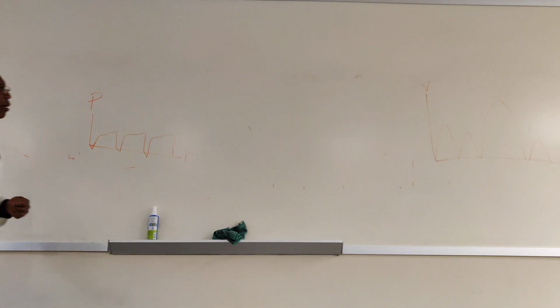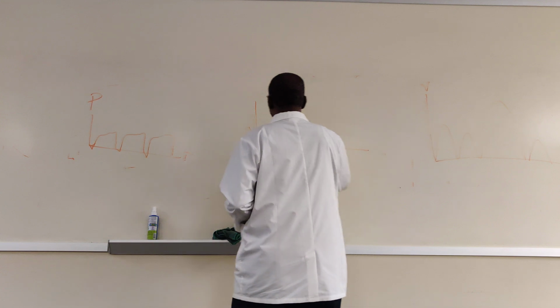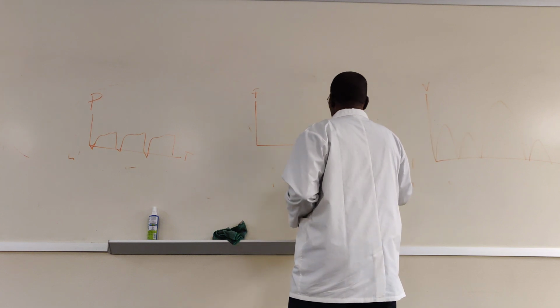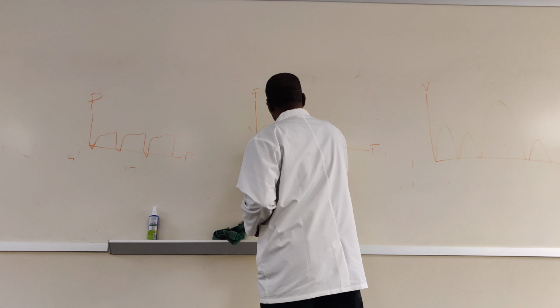And then for the flow time curve, what we call that is the sine flow pattern. The sine flow pattern. So it will look like this, a spontaneous breathing.